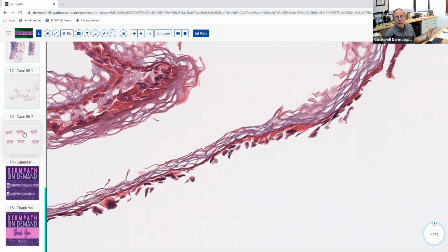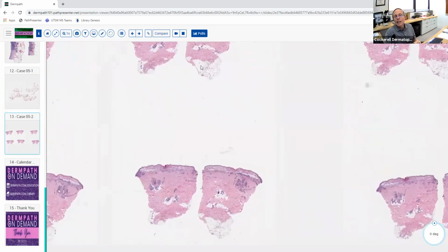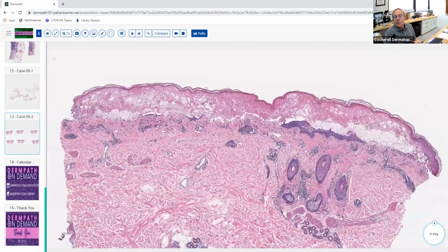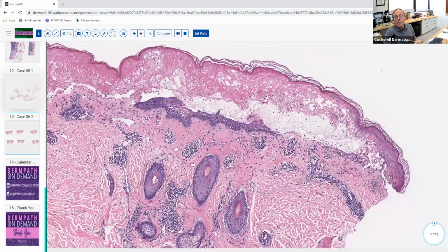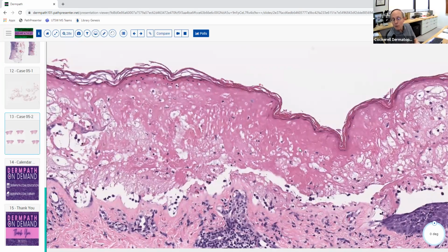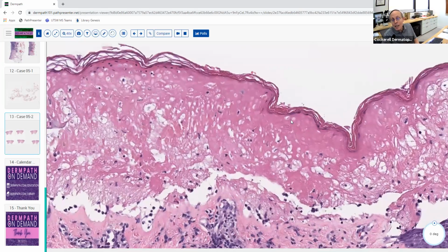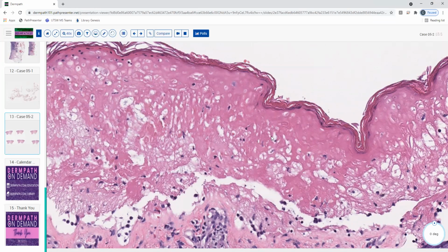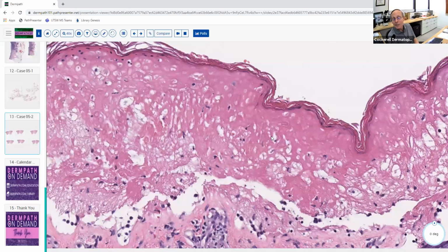Okay. Now this one, this isn't a jelly roll technique, but this is erythema multiforme or TEN. Here you've got total 100% necrosis of the epidermis. If they brought you a jelly roll that looks like this, what are you going to tell them? TEN. Yeah, you're going to say, don't go home. Get them in the ICU. This is a burn unit situation.